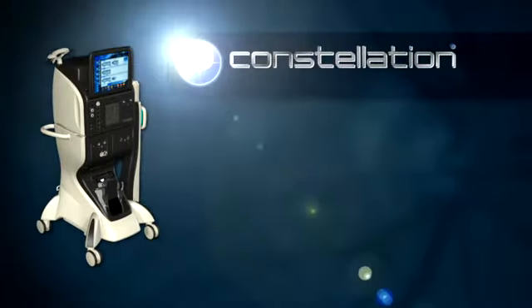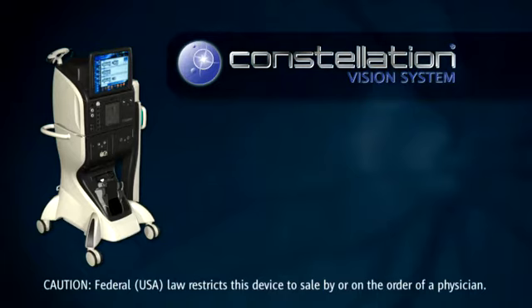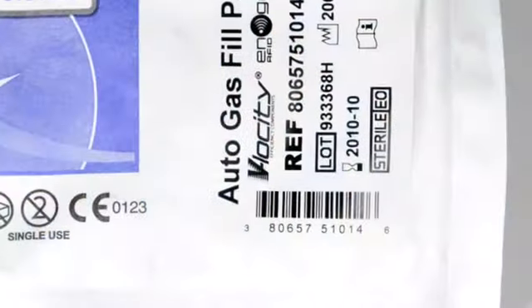In this video, we demonstrate the setup of the auto gas fill. The Constellation System Auto Gas Fill Pack provides the necessary accessories for single-person acquisition of gases used for intraocular tamponade.